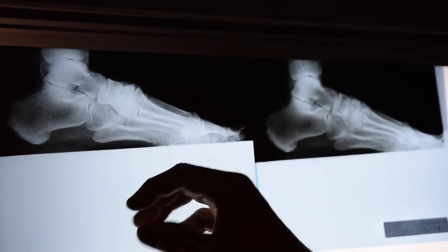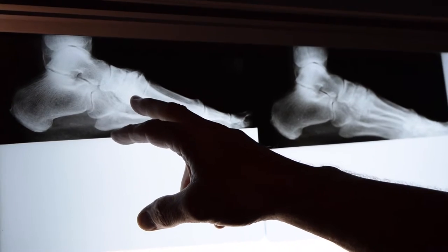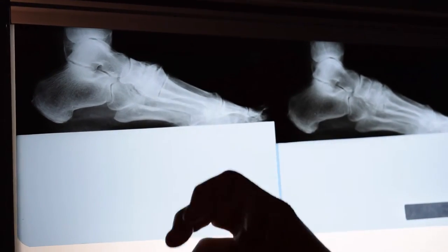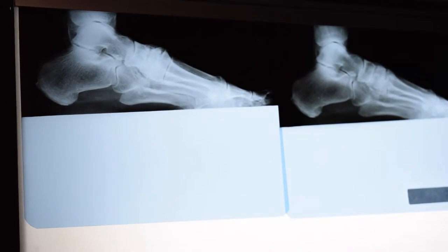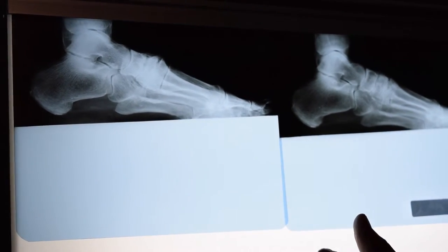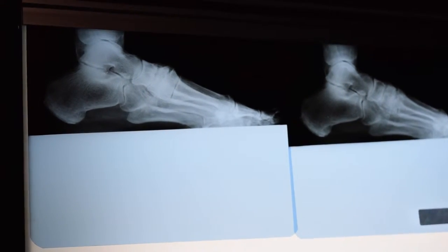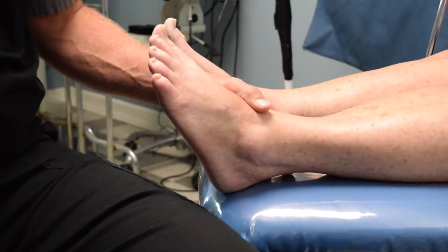However, this patient had an unusual issue. This occurred from an injury she sustained when she was 12 years old — she had a fracture of her foot and injuries to her lower extremity, so she doesn't have a gastrocnemius. Performing a gastrocnemius recession would therefore be inappropriate. We wanted to remove this exostosis without leaving her with any neuritis, so we performed this with minimally invasive surgery.